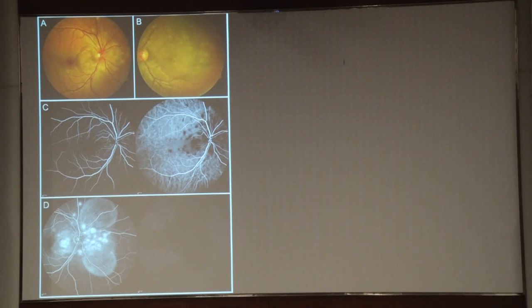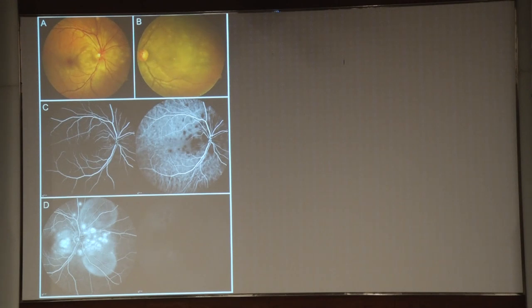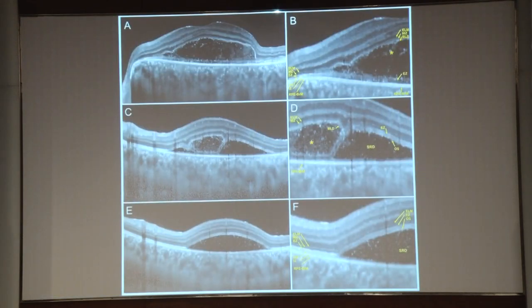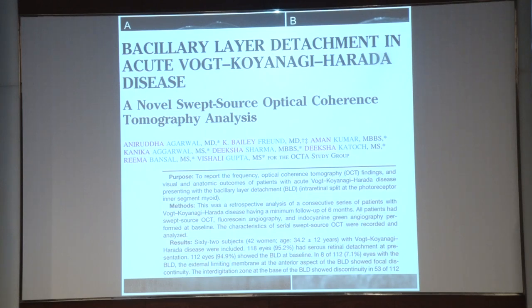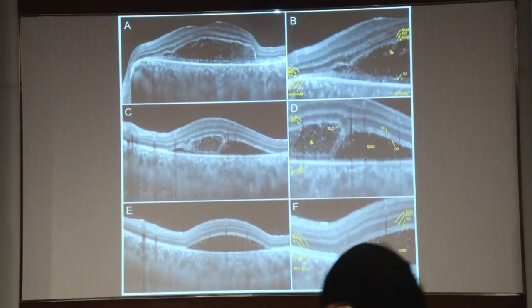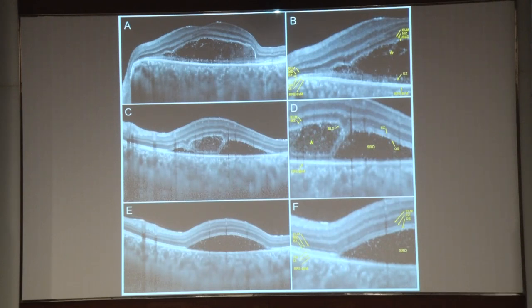VKH — this is a classic textbook picture, and many colleagues tell me they have a unilateral VKH. But remember, unless you have an ICG, you cannot really say if it's a unilateral or bilateral disease. VKH, by definition, is a bilateral disease. You can see the textbook picture of choroidal granulomas in the stroma, and the fluorescein shows multiple hyperfluorescent areas with pooling of the dye. In VKH, you can have compartmentalization of fluid on OCT, though this is not specific to VKH — you can also find it in MPPE and other disorders. This is a publication on bacillary layer detachment in VKH, essentially demonstrating the compartmentalization of fluid.